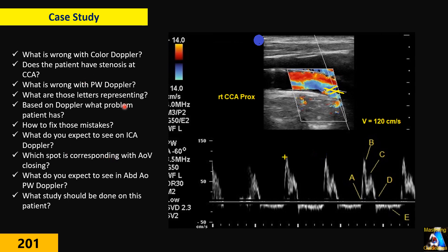Here we have a patient, 55 years old, with dizziness. He has been sent for a carotid ultrasound. In one of those views, as you can see, the tech shot the proximal right CCA — common carotid artery — proximal. The tech performed a duplex study: color Doppler and pulse Doppler together. Based on this duplex, what is wrong with the color Doppler? Does the patient have stenosis at this level?